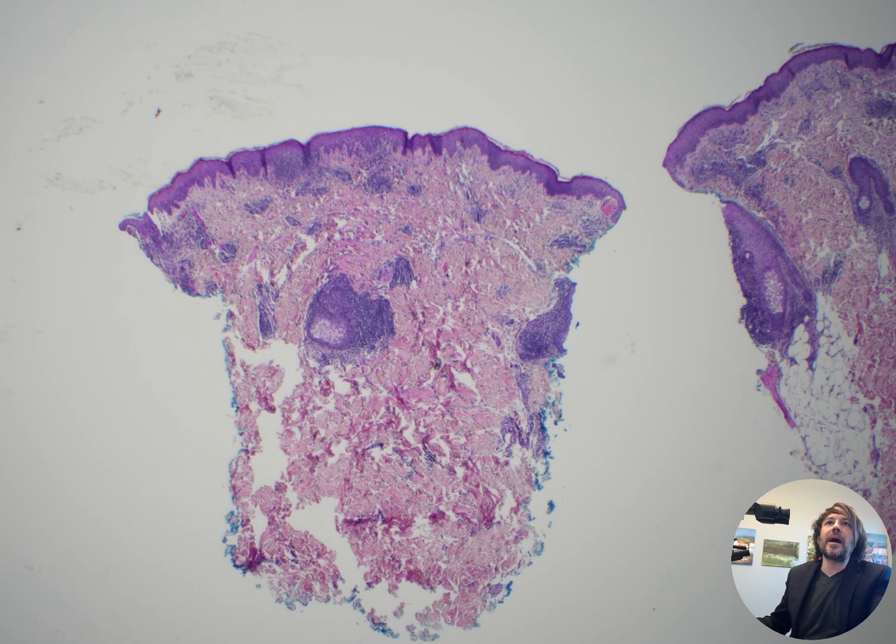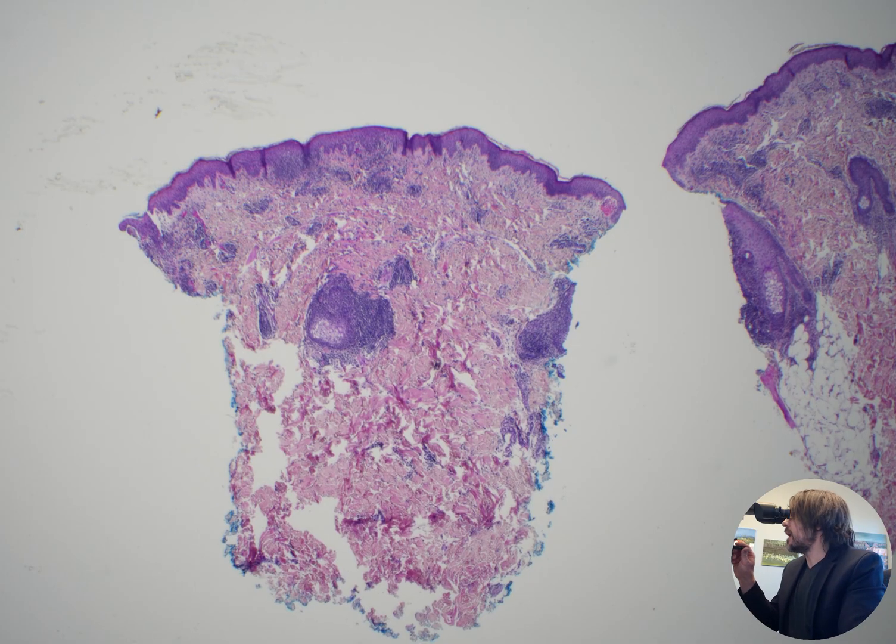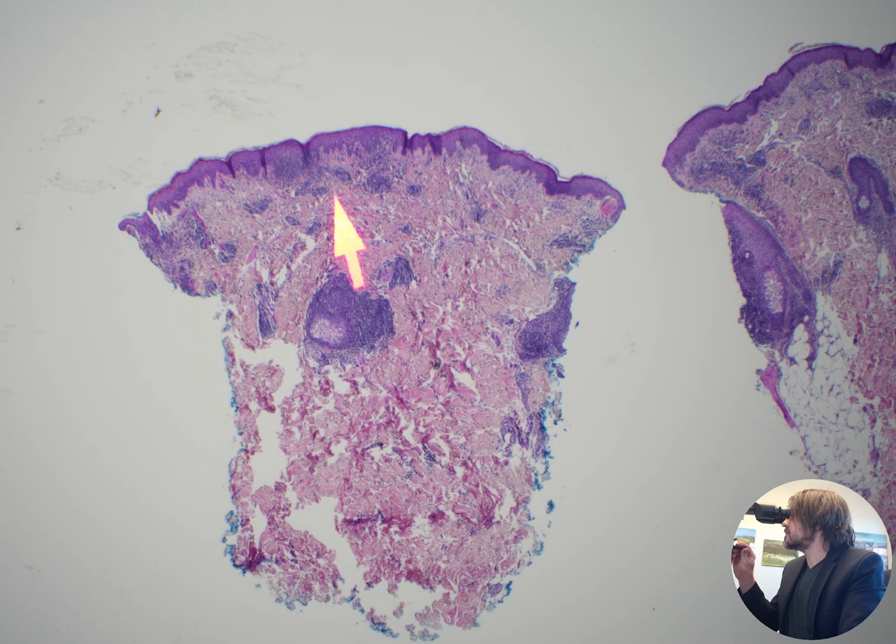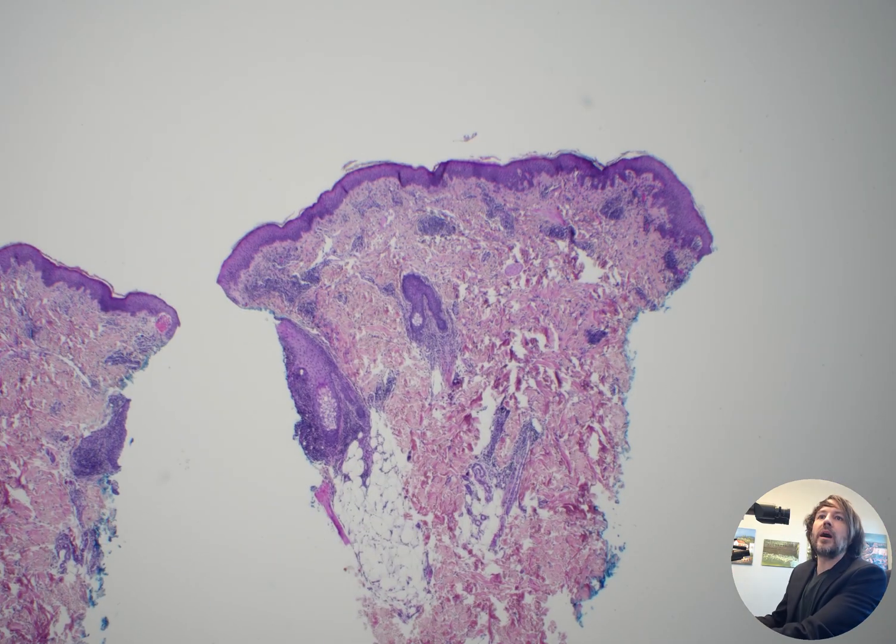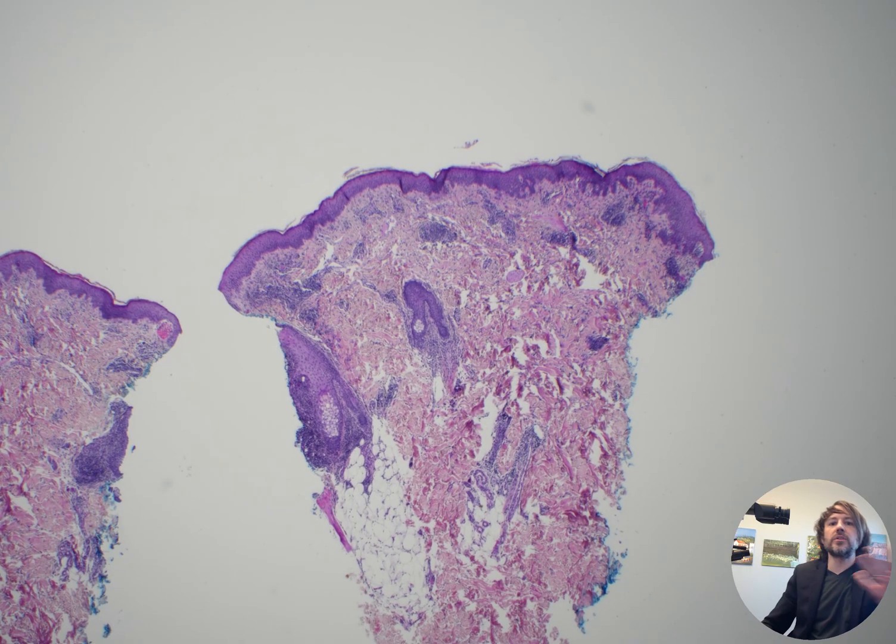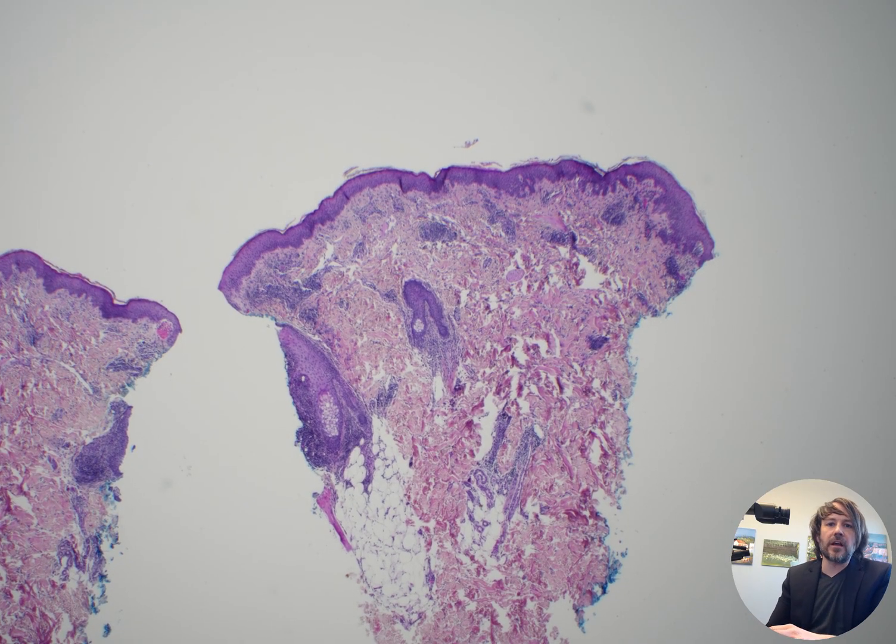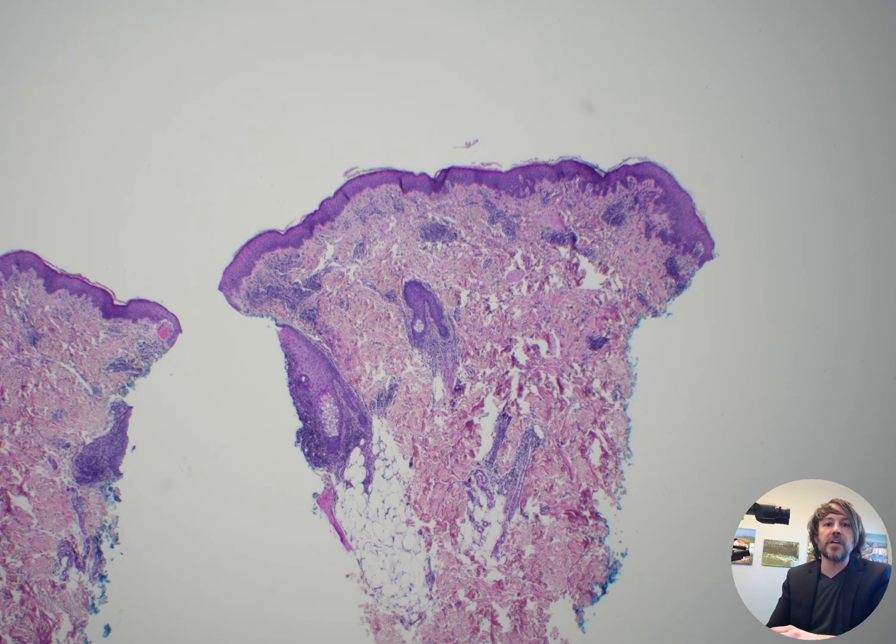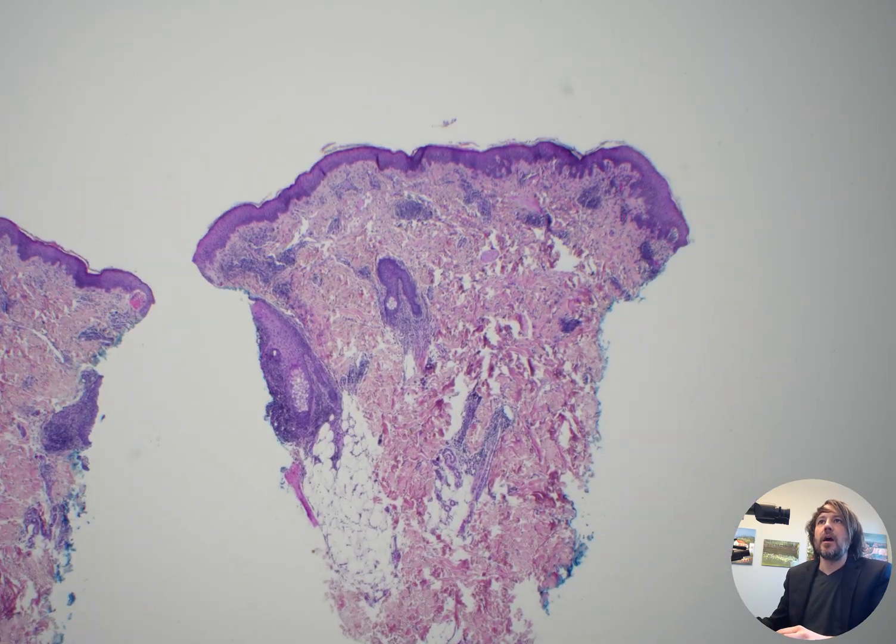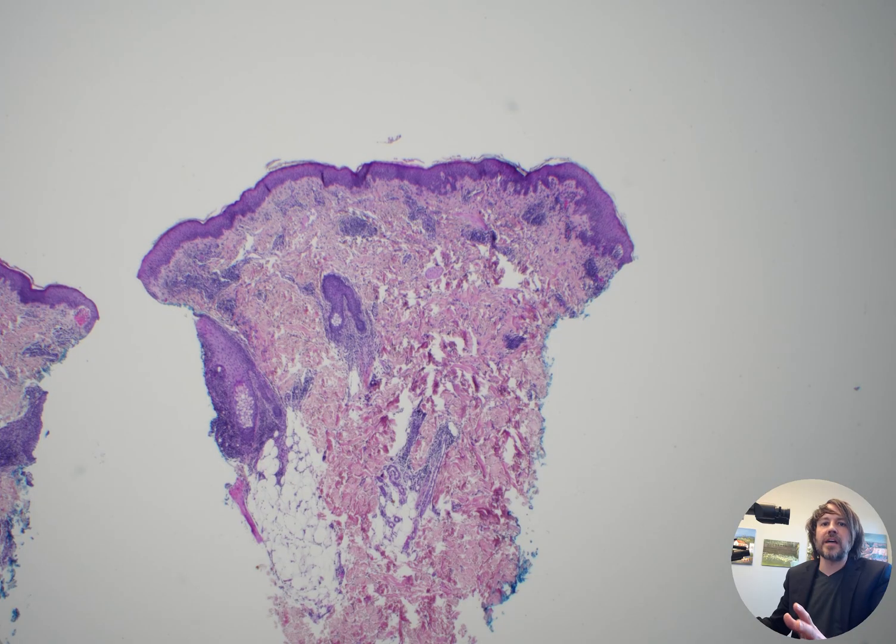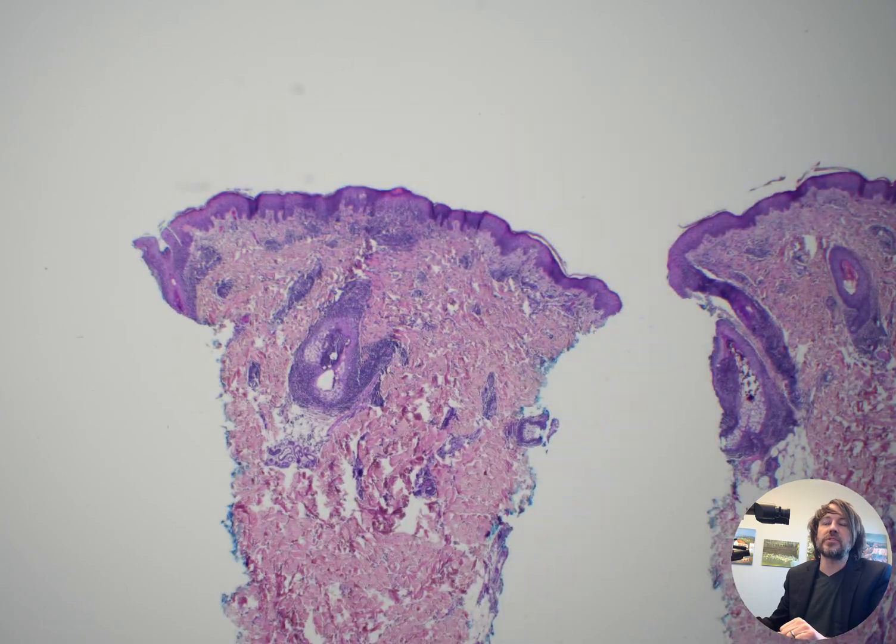And when I first put the biopsy down, you can see there's a lot of inflammation around hair follicles and sebaceous glands. And there's also some spongiosis and inflammation up here, some edema.